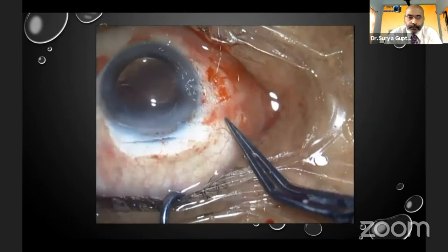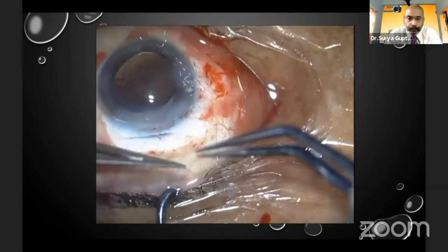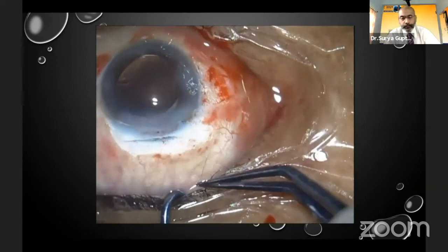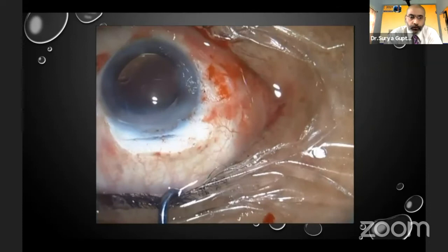Now the last going to the other side, I put a triple knot suture and I pull too hard and I have torn off one end of the suture. I still haven't realized I have torn one end of the suture. I'm still trying to tie it and then I realize I've torn it. So now I have one end completely sutured, the other end just held in position with the help of one triple knot. Now what to do in this situation?